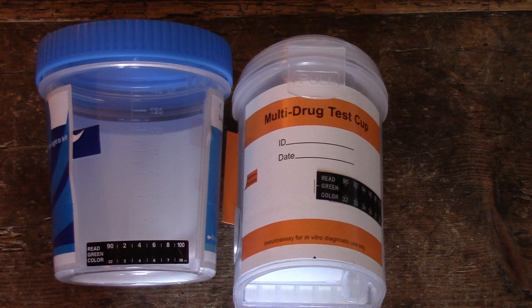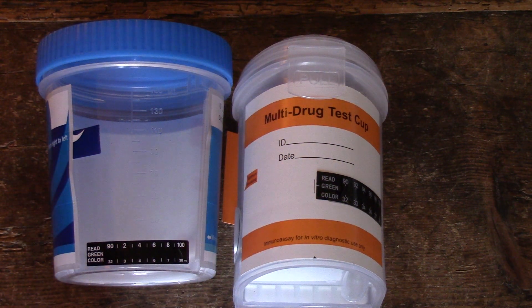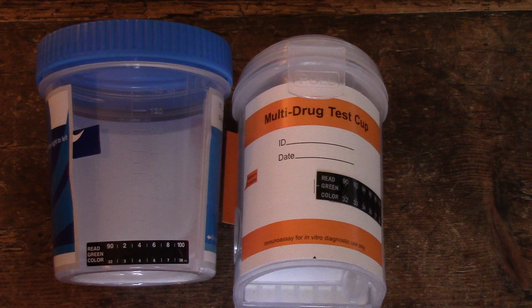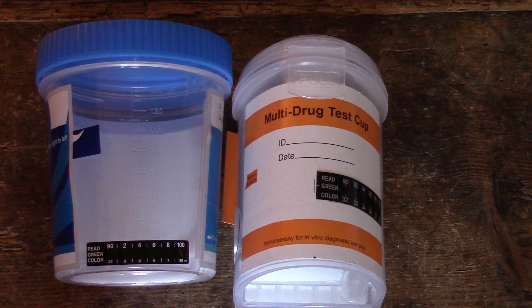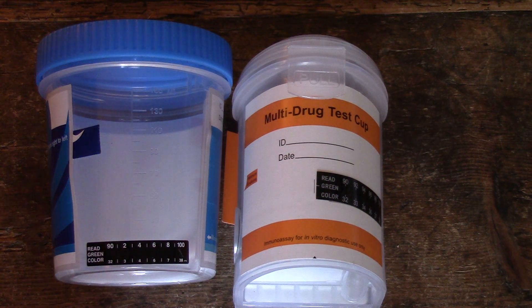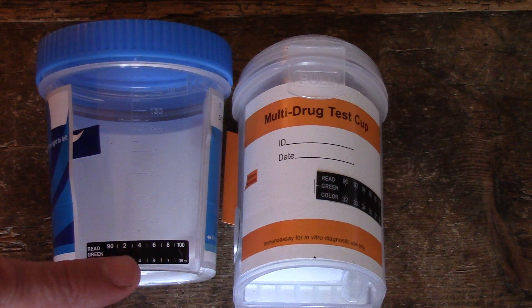Welcome to this presentation video where we're going to talk to you about the interpretation and use of temperature control strips or temperature test strips, which are usually embedded onto the sides of drug testing collection cups or integrated cups. What you've got in front of you here are two different designs of integrated drug test cup available from UK Drug Testing, and on both of them you'll see these black liquid crystal temperature check strips.